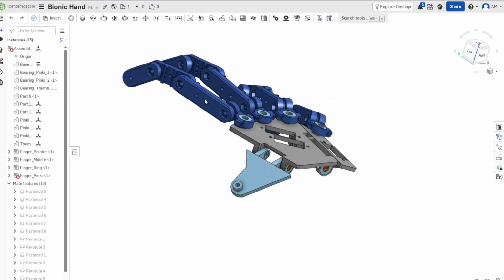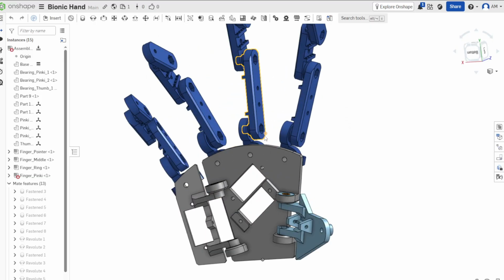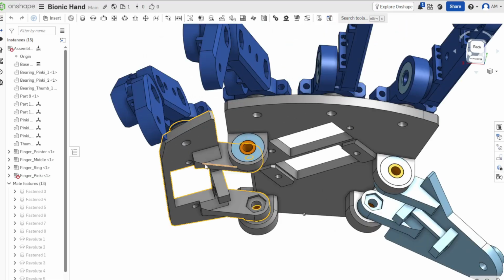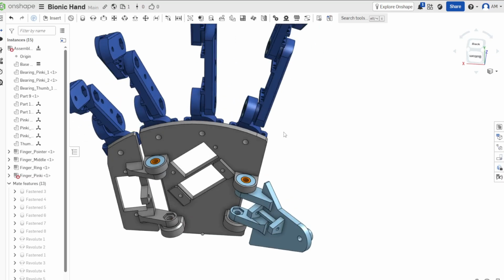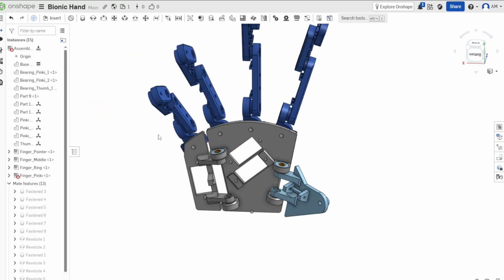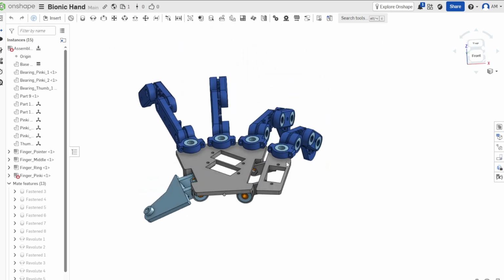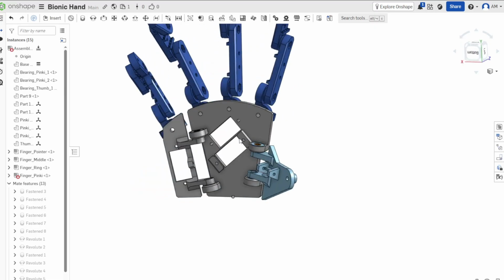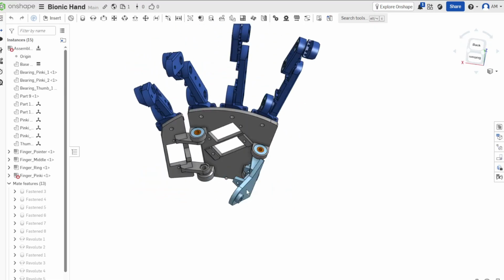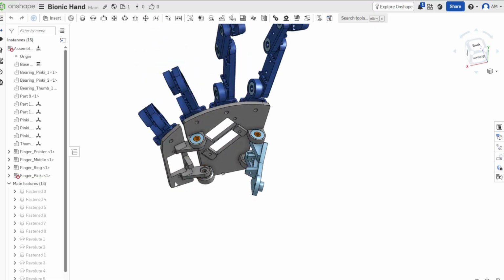So I think why this is potentially better than what's already on the market is because one, this is dirt cheap to print, right? But two, a lot of them are just a fixed 4 fingers that can bend straight, and that's about it. Maybe you got a little opposability in the thumb. This is designed to be very tendon driven, and it doesn't have slop in the joints, but it allows for bendiness and conformability. So you do have a full opposable thumb here, and I'm working on adding another finger to it. You also have a pinky.